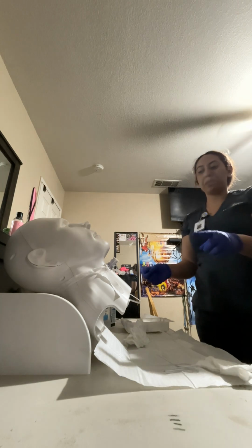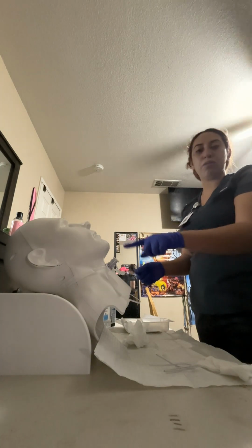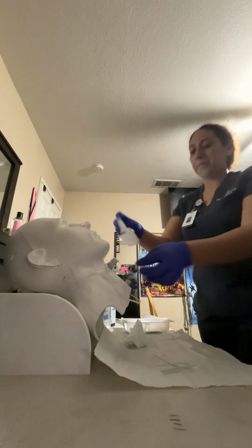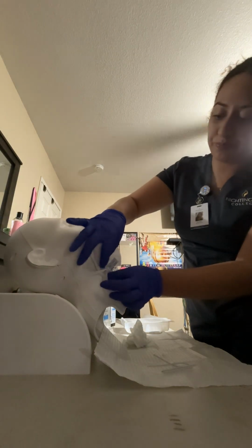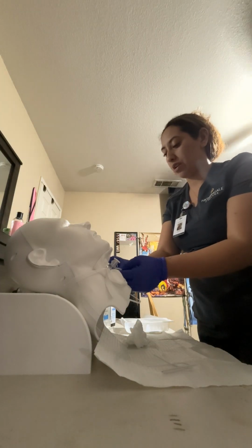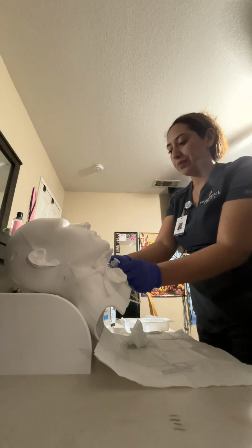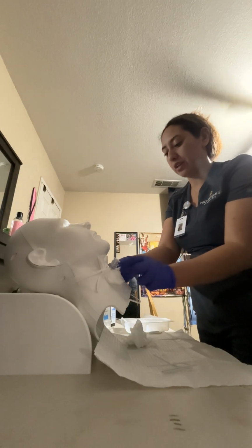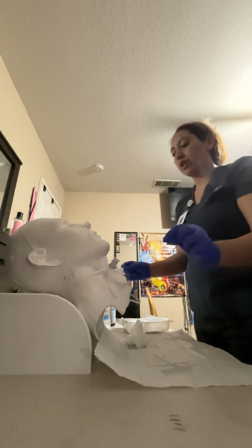Next, I'm going to replace the split gauze around the patient's stoma. Okay. I have replaced the gauze.